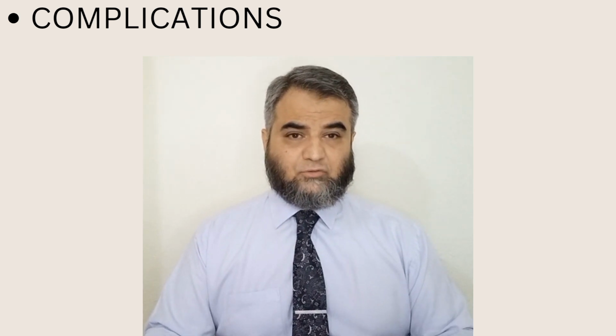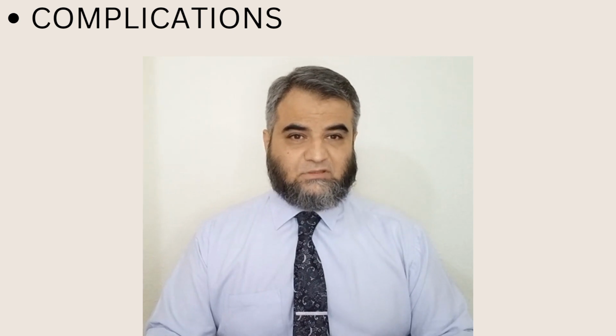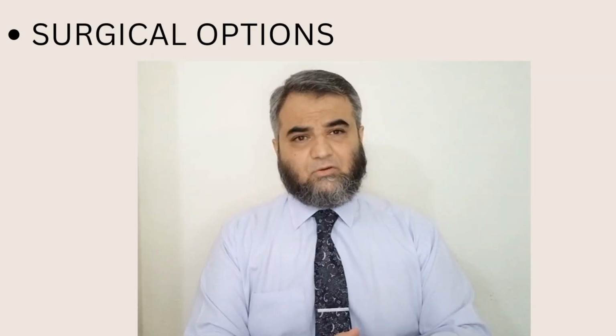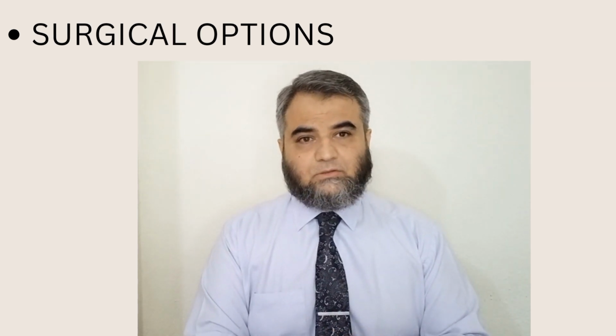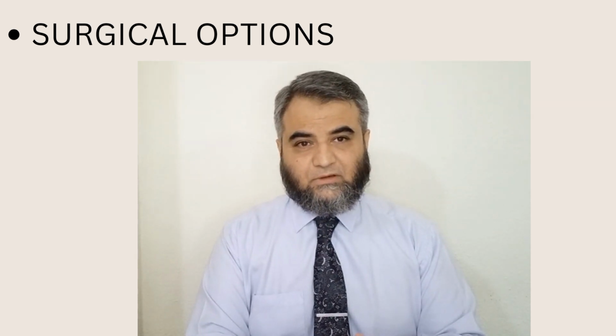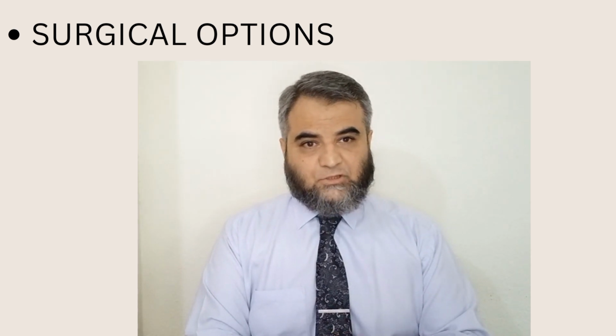So whenever we are going for surgical management, for example, this thing should also be kept in mind. When we decide about the surgical management, we can do irrigation and aspiration. We can use a vitrectomy cutter for hyphemectomy, and clot expression can be done.